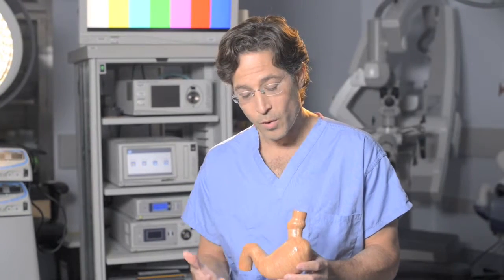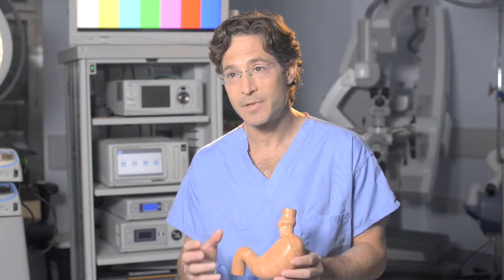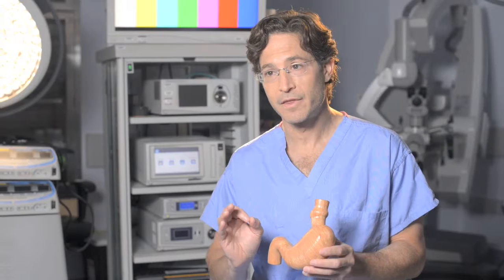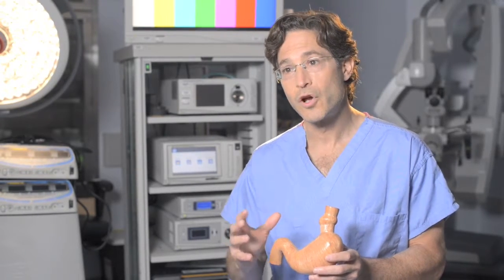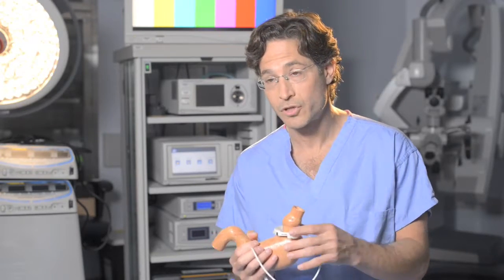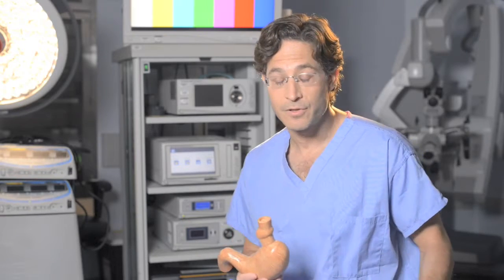All right? So with the band, for example, someone might come to me and say, I just can't accept an operation that's irreversible. I want to feel a certain level of comfort that if there's reason to reverse this, we can do that. And that certainly is an advantage of the lap band. There are other people who don't want a device, which is what we're dependent on. We're dependent on a band that sits around the stomach, potentially for the long term. And there are some people that are just not comfortable with having a device inside of them. And for these people, we have options that include the sleeve gastrectomy and the gastric bypass surgery.